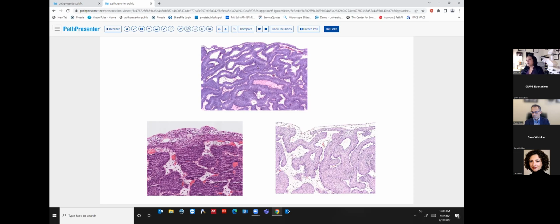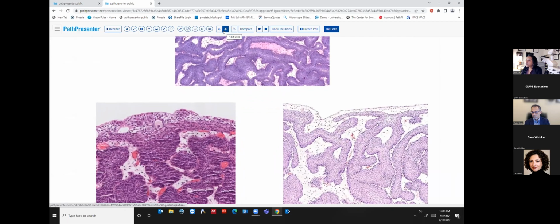One thing that is common, as you can see, is the ribbon-like or trabecular growth pattern that you can recognize in all three lesions. And at low power, a classic inverted papilloma will have a nice basal layer that you can easily recognize. Sometimes it's more prominent and other times it's less prominent. The stroma is also variable in amount. It can be edematous, very well separated out, with edematous stroma that separates out the cords, versus those that are more compact.